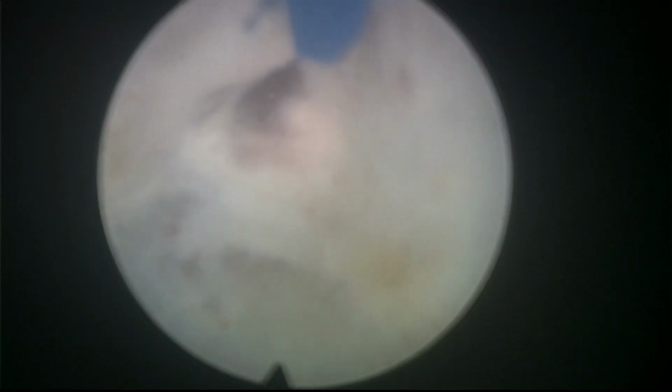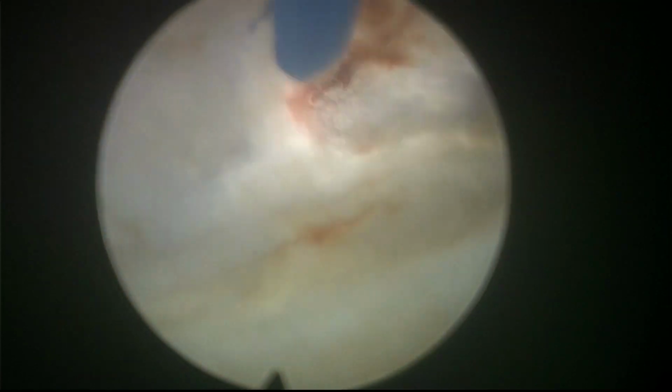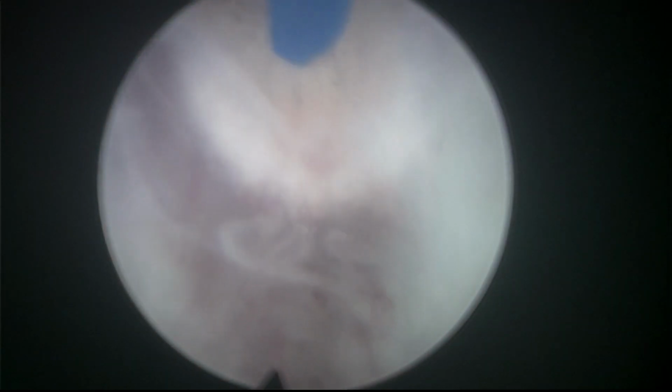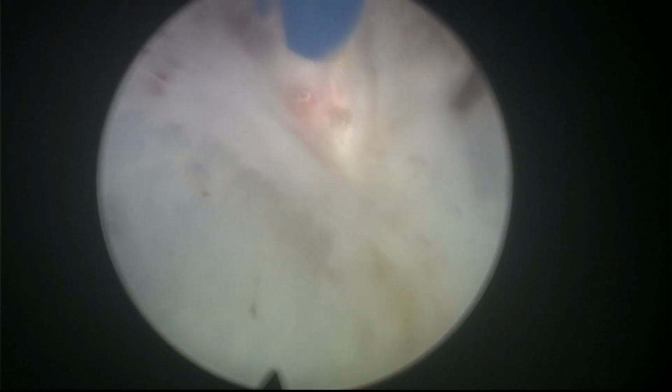Sometimes you need to almost contact with the tissue in order to be able to cut through fibrous parts. But the solution for these problems is usually quite easy.